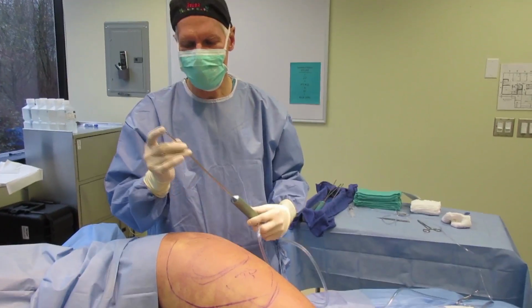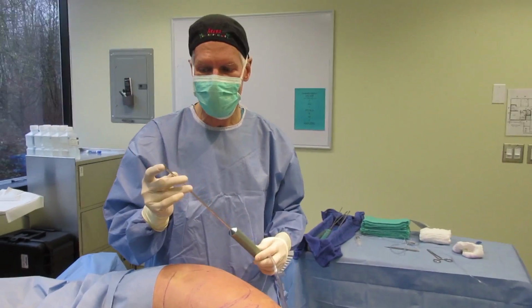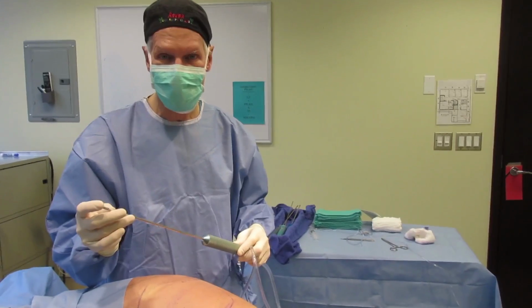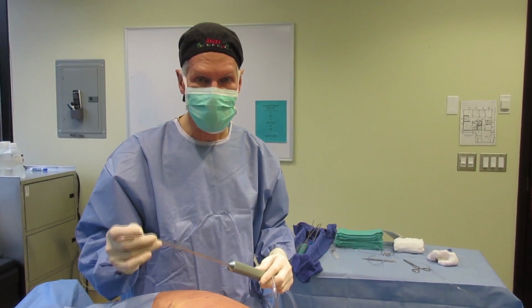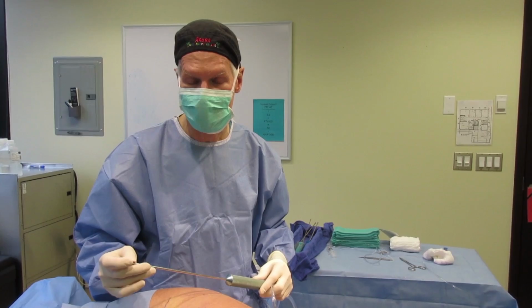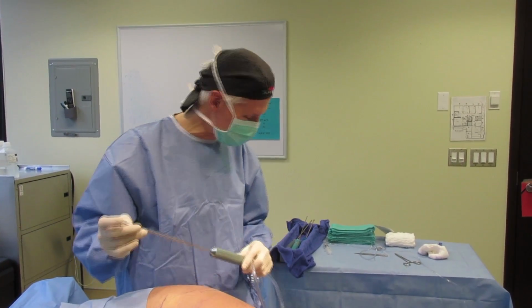Okay, so now here is a liposuction cannula. There are many different styles. This is one I prefer generally, a Mercedes tip. It's 4 millimeters in this setting. Sometimes we use smaller ones, and sometimes we use larger ones with baskets where we oftentimes don't use suction. That's all part of our SAFE lipo, S-A-F-E lipo system.